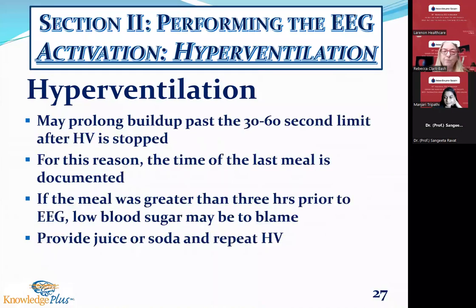So again, if they have hypoglycemia, it can prolong that buildup response. So we document the time of the last meal, and I think a 3-hour window is safe. I want them to have a meal within 3 hours of their EEG. If it was greater than 3 hours and they have prolonged buildup response, it could be low blood sugar.